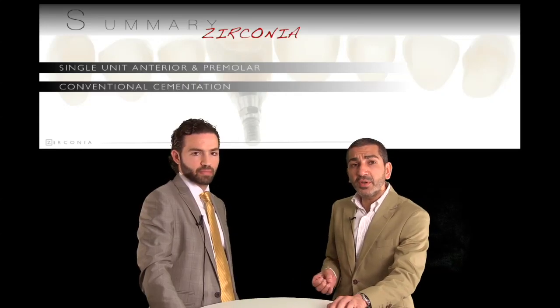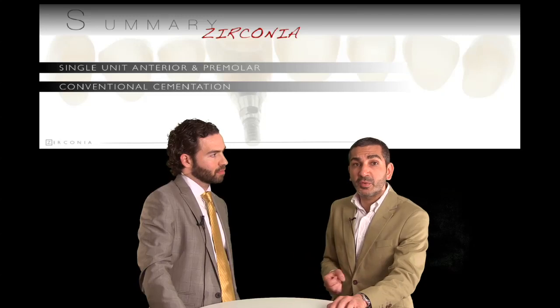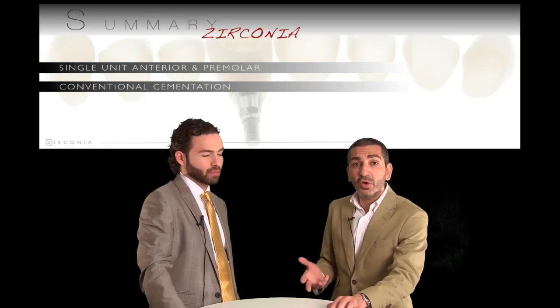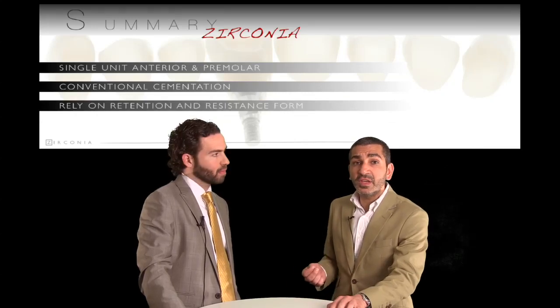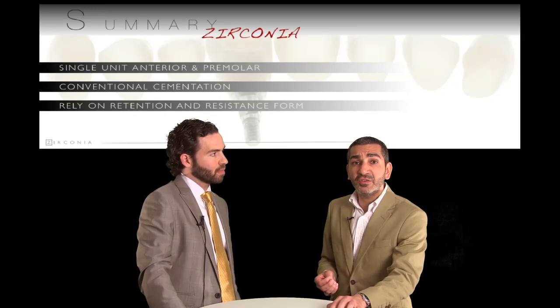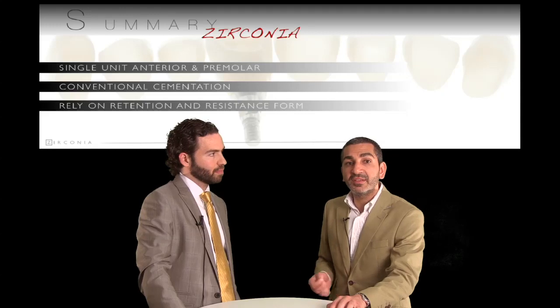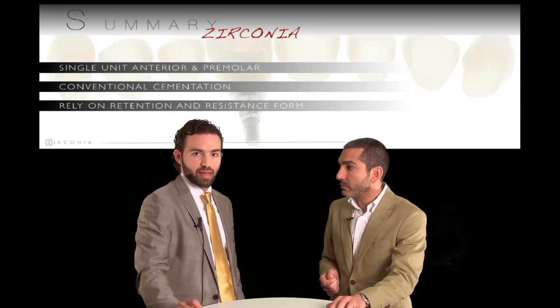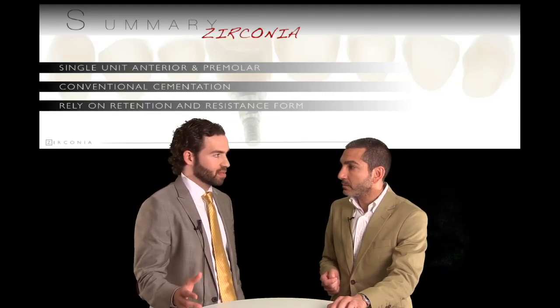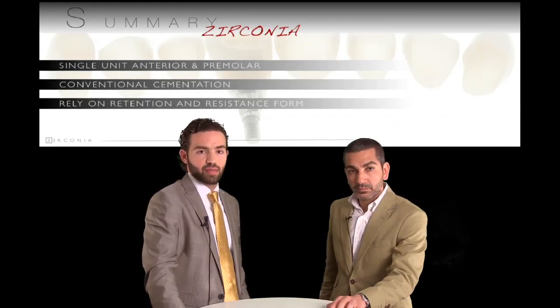The other advantage of zirconia is that you can conventionally cement it. You can just use normal cement, whatever it may be, glass ionomer, resin-modified glass ionomer, zinc phosphate, and cement it on, and it makes life a lot easier on the day of delivery. So in simple terms, you just do not need to etch the material. In actual fact, you cannot etch it. So that's why we use cementation as the means of delivery of these types of restorations. And since you cannot bond zirconia-based restorations, then you have to rely on retention and resistance forms and everything we've learned in fixed pros from our dental schools.